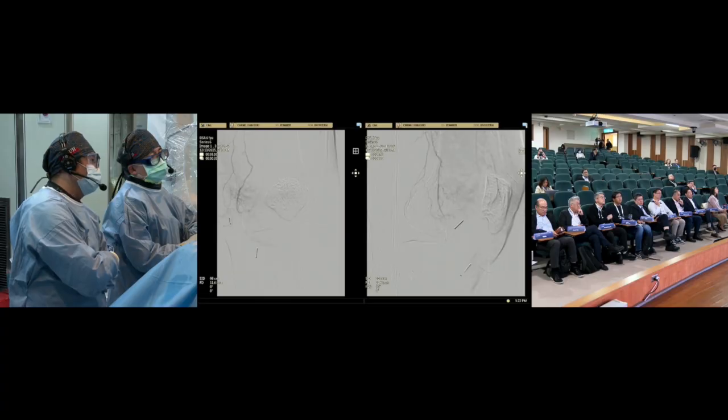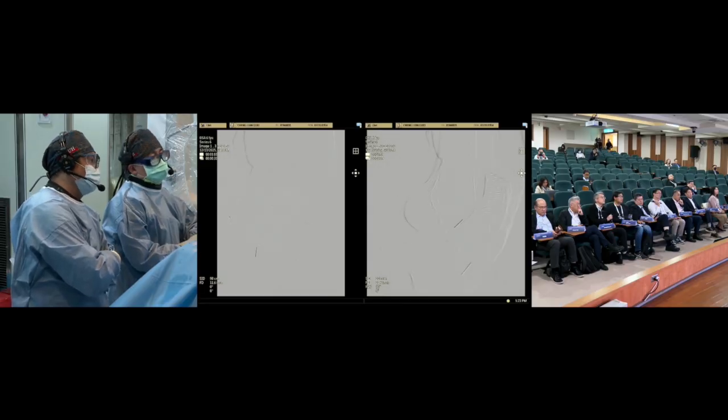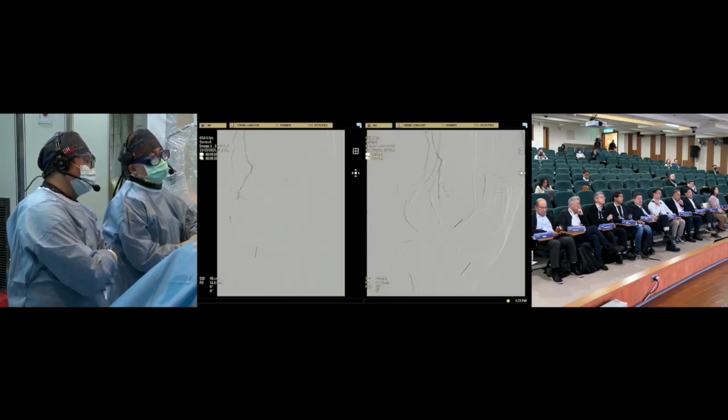And this time you will see some new angiogenesis proximal to the knee joint. That is the muscular branch. Please don't do further embolization, because that is not angiogenesis within the joint, but within the muscle and some soft tissue. This is enough. Don't do more than 2 cc per genicular artery.